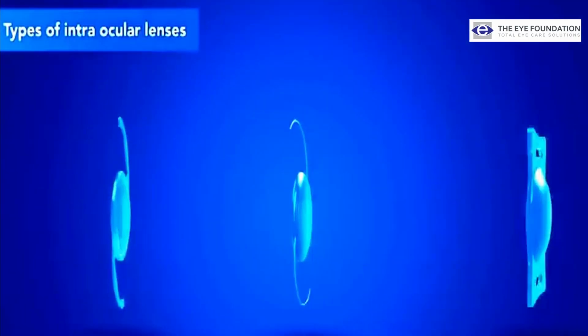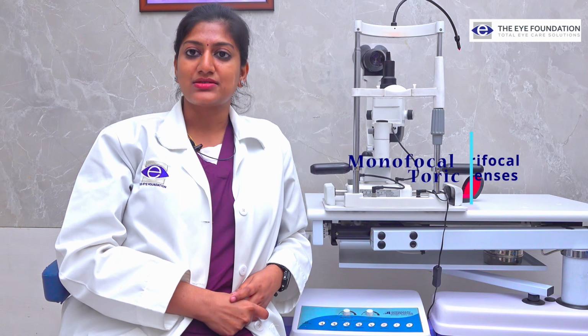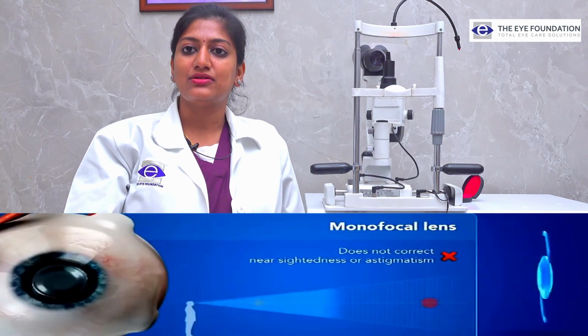In such cases, this clouded crystalline lens can be replaced with an artificial intraocular lens, which is generally a safe procedure. Let's see what the types of intraocular lens available in the market are. There are three types of intraocular lens which are available in the market: monofocal lens, toric lens and trifocal lens. Monofocal lens provides the clearest vision at one distance, near or far.